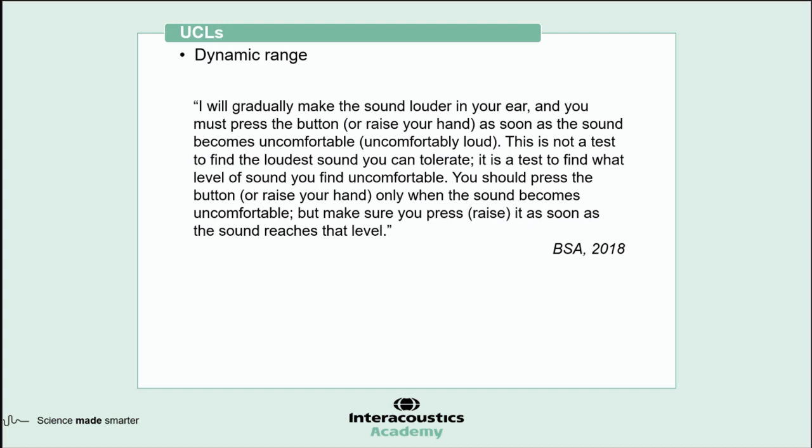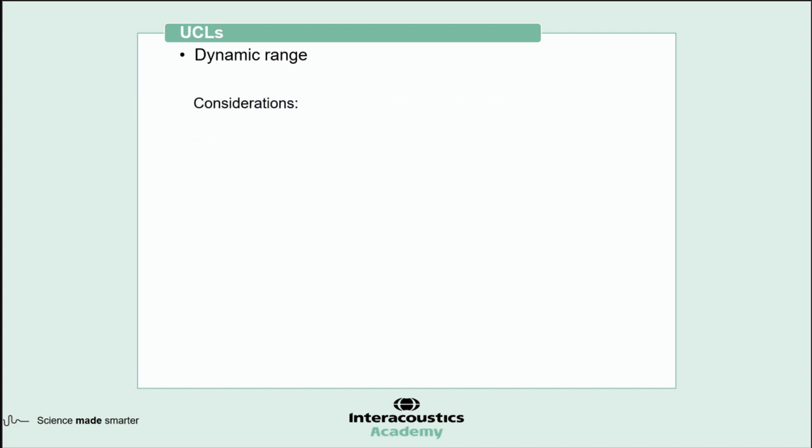There are some considerations that we need to bear in mind for uncomfortable loudness level testing. Tinnitus and hyperacusis patients, probably not recommended because you can really trigger their symptoms. There's also the potential for threshold shift. So I know many clinics will only do maybe 1 or 2 frequencies in each ear, or they might do, say, 1 kilohertz and 4 kilohertz in one ear and 2 and 0.5 in the other, so that if the patient does not understand the instructions properly, they aren't sitting there and bearing through quite so much presentation, which could then cause a threshold shift across the full range. So that's an interesting one to bear in mind.